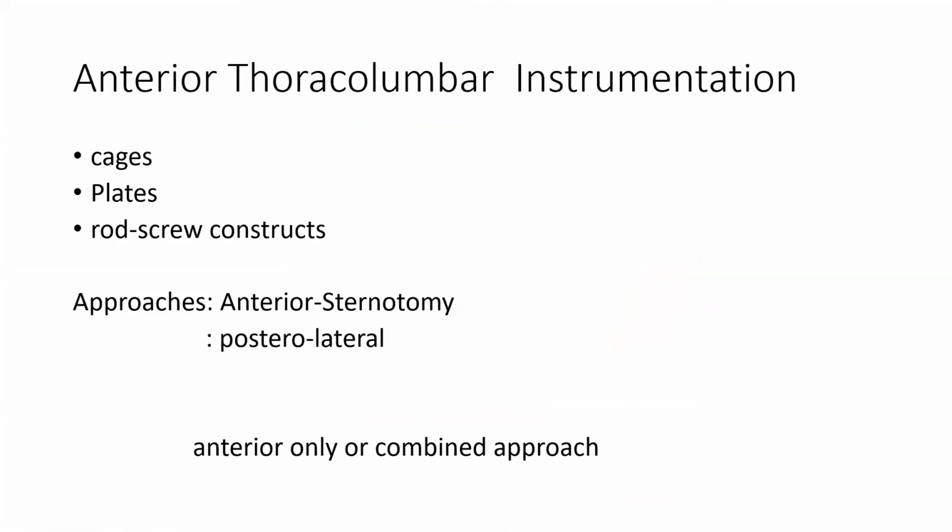Okay, so I'm going to talk a bit about your thoracolumbar instrumentation from anterior. We've got a bunch of tools you can play with, from cages to plates to rod-screw constructs.